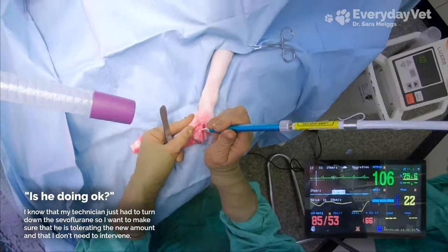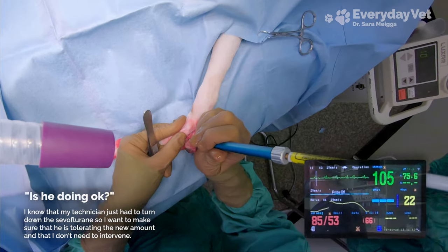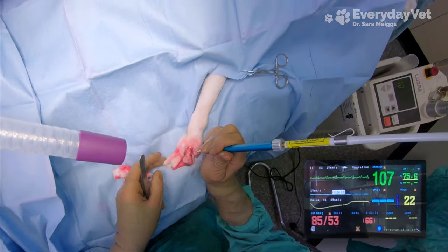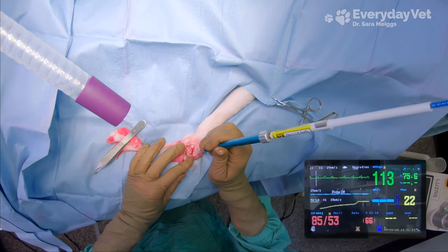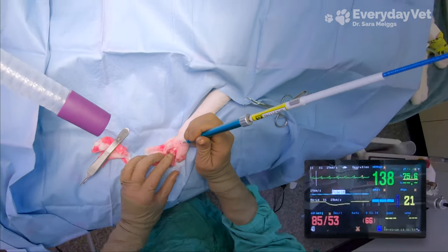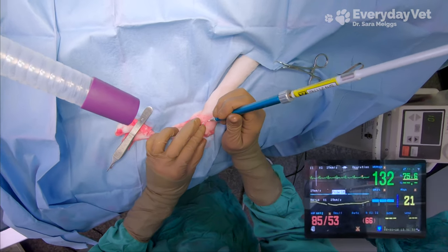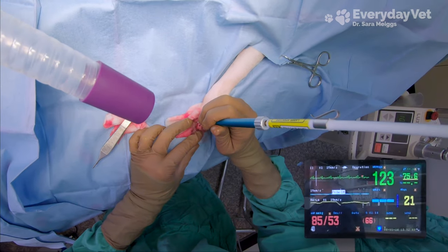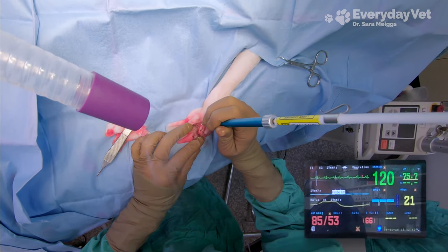The toes are a very delicate region because they're used for balance and for tactile sensation, so there's actually a lot of nerve endings there. Now that I've made my way through the skin layer, I'm going to have to cut through those more sensitive tissues between the toes in order to get that toe separated out, so I'll likely be cutting through some of those nerve endings. Because of the added stimulation, the assistant may end up having to turn up the sevoflurane in order to keep him asleep.